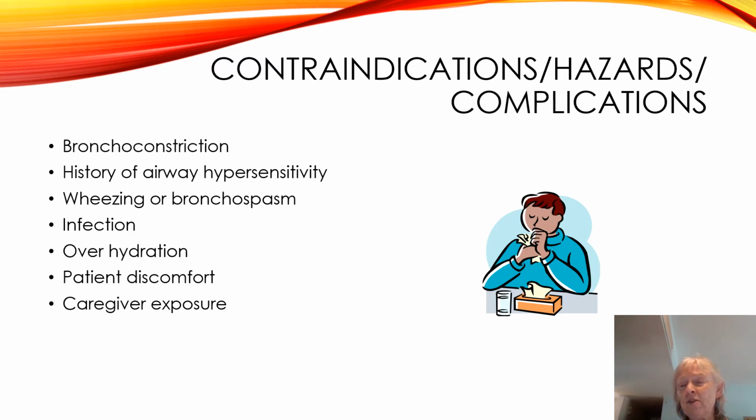They may have something else that's going on with their lungs, and they're being exposed to the medications that they have to take. And if you have an overexposure, remember you can build up tolerance to it, or you can have tachyphylaxis if this just happens to be the wrong time in the wrong place and the wrong day. So one of the things they were trying to do was tell the manufacturers, with your small volume nebulizers, you want to make sure that the patient has the majority of the medication and that we're not seeing a lot of caregiver exposure.